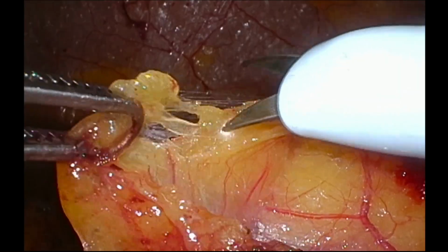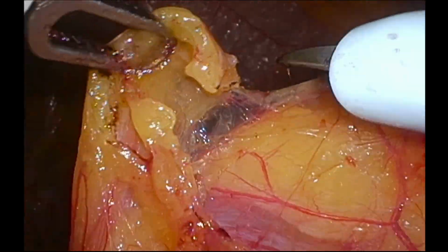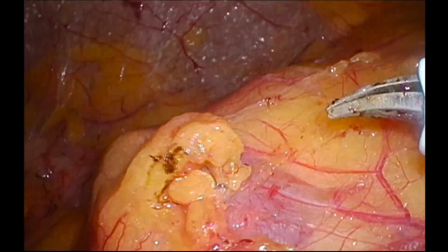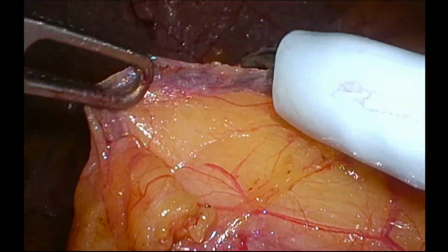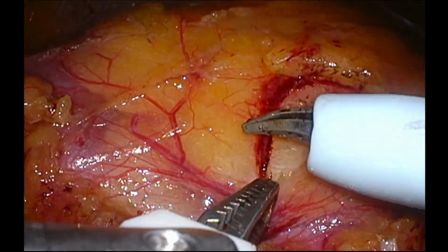When dissecting near the kidney, one has to be careful to dissect the colon from the medial surface of the kidney and renal mass. If you go too much lateral, you will reach the posterolateral surface of the kidney and the kidney will start dropping.